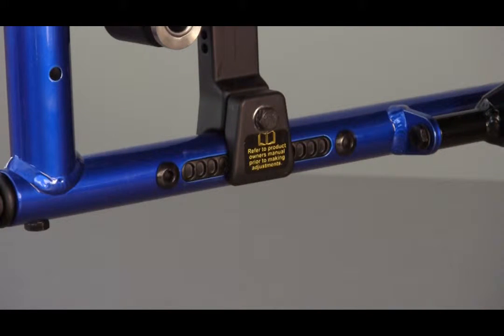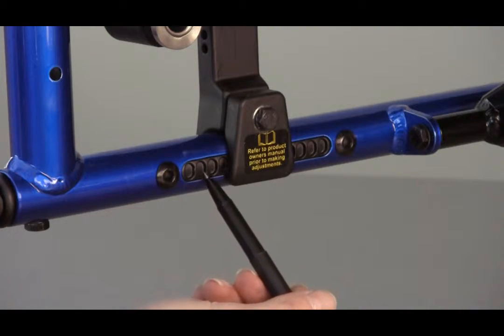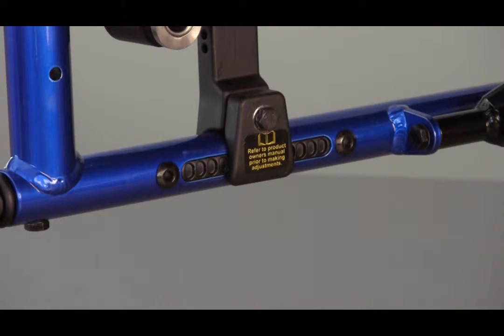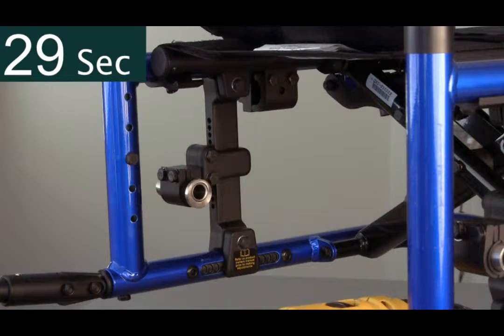To ensure the other side is moved to an identical position, count the indexed holes behind the axle plate. In this case, there are four. Each side can be adjusted in under a minute.